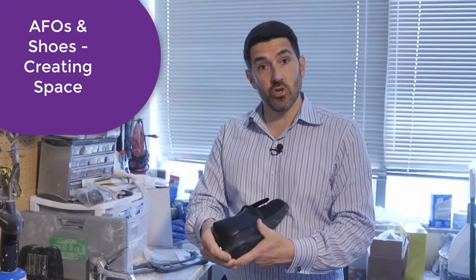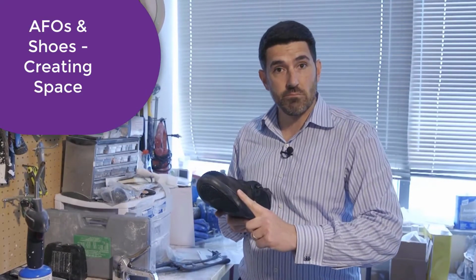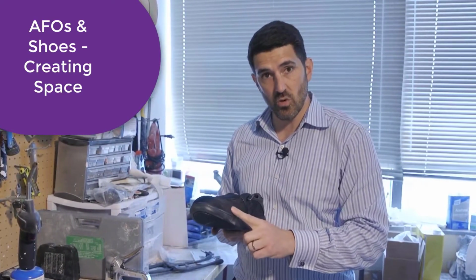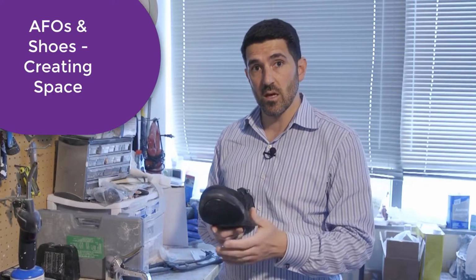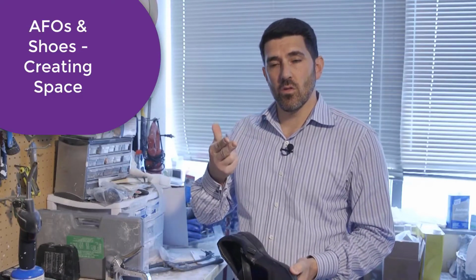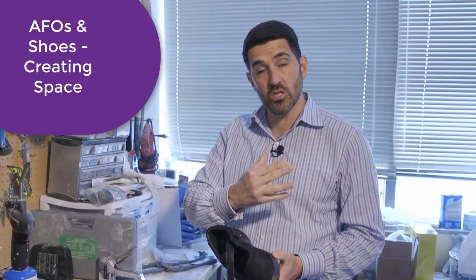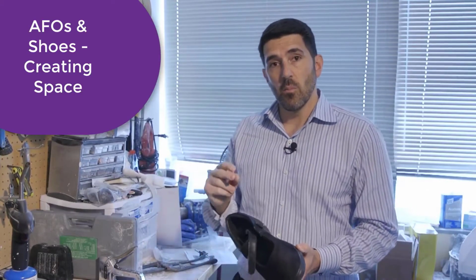The other option you can do is, we'll say at the bone right here, or the brace is pressing out, or something's not working right. It's too tight right here in the shoe. One of the things an orthotist can do for the patient is actually use something called a shoe stretcher. The point that I'm trying to make to you is that we can make more room inside of the shoe for the patient. It does change the shape of the shoe slightly, especially in the beginning. But you have an option.